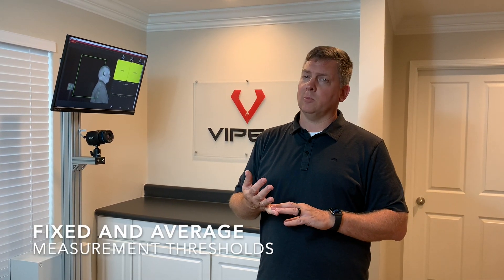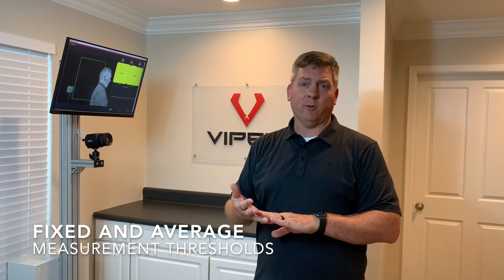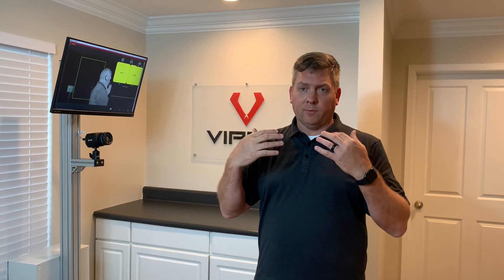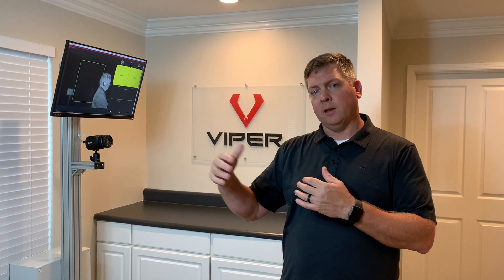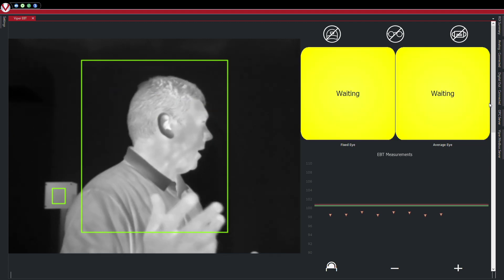We're actually doing two different measurements here. We're doing an absolute temperature measurement, looking for anything over a certain threshold — say 100.4 degrees. At the same time, we're doing an average measurement so that if outside conditions are different and people are walking right in, the temperatures are going to be different. So you want to maintain an amount over a certain threshold. For instance, if everyone comes in and it's 94 degrees, you want to say anyone two degrees above that, let's flag them and bring them off to the side. When they come in, simply standing there with nothing else to do, it takes a measurement and says processing, and allows you to pass or fail.